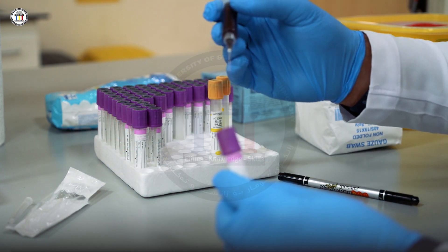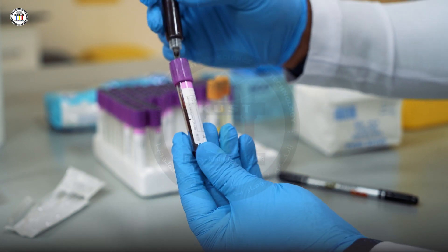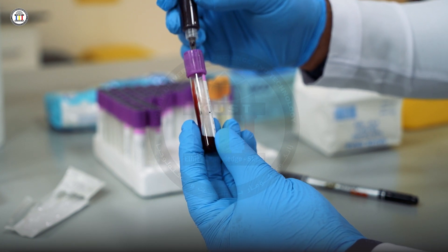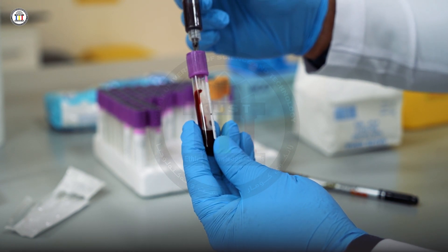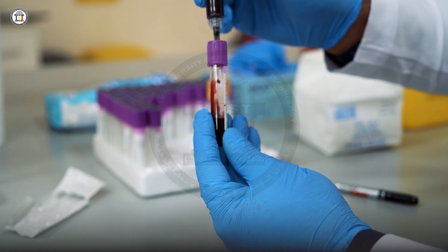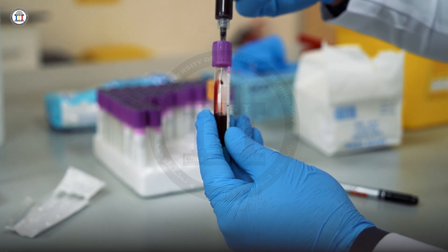Transfer the blood directly to the test tube based on the order. Here we need a CBC, so I'm going to transfer the blood into the test tube with EDTA. Do not press the plunger — it will cause hemolysis. The blood will go automatically because of the negative pressure inside the test tube. You have a line on the tube, so you have to reach that line.